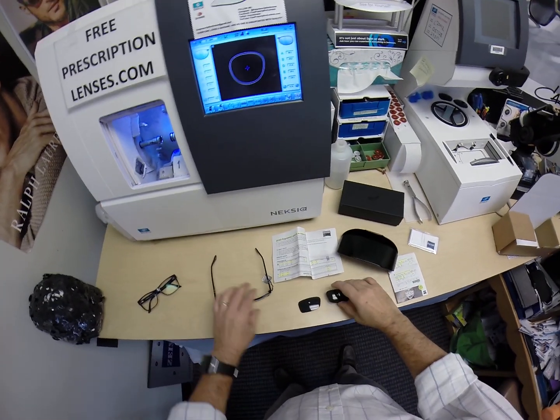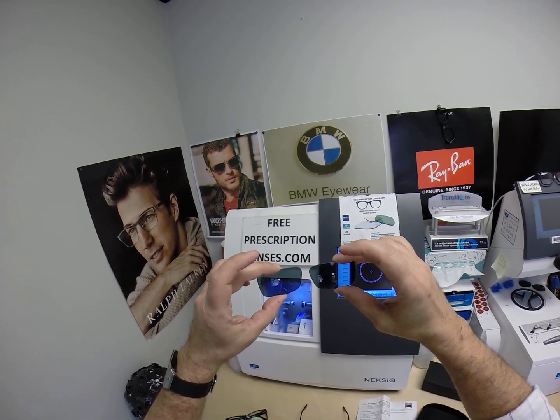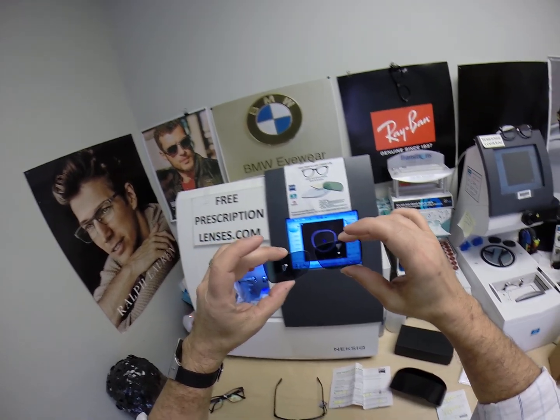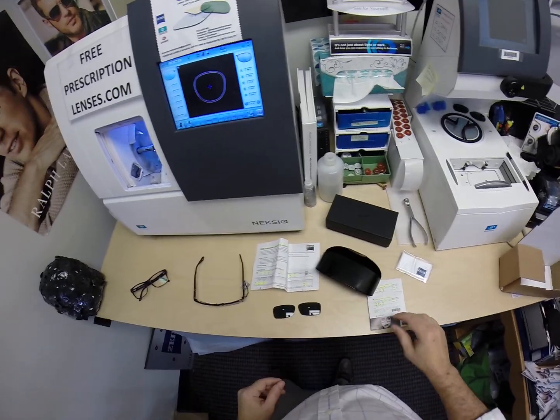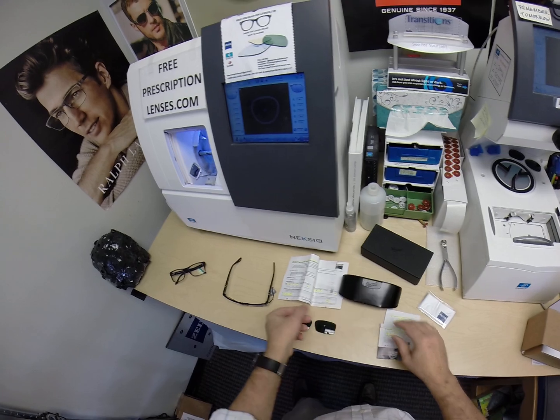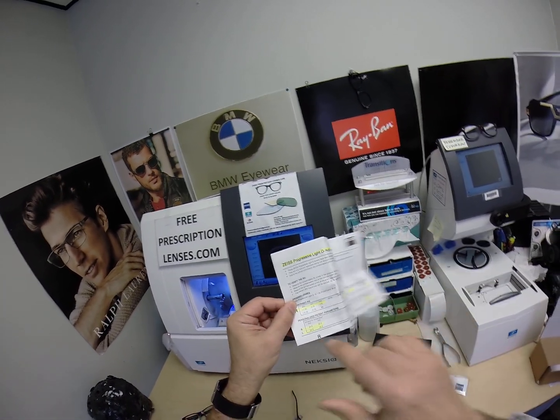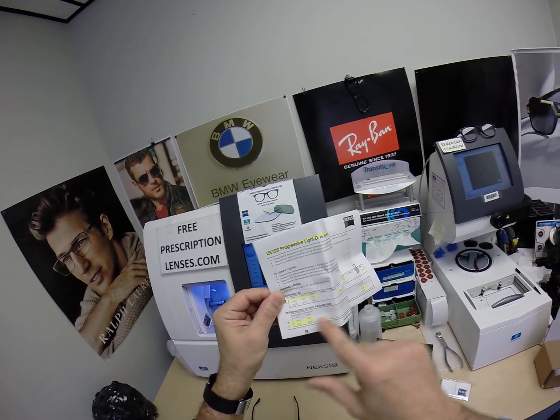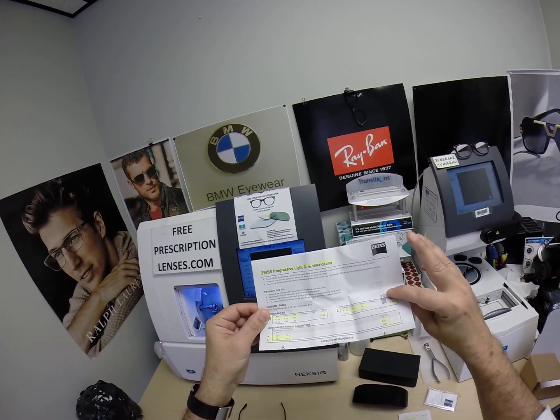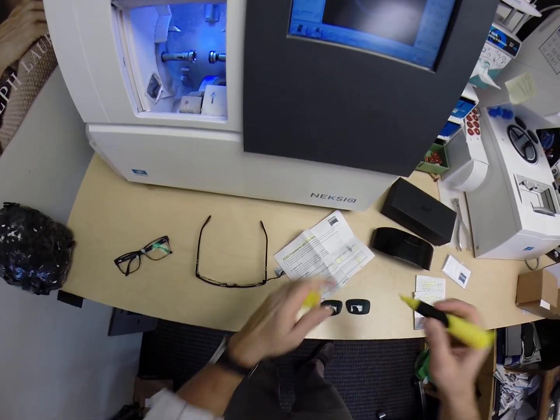One more thing I wanted to point out. For his progressive lenses, I had him put a dot on the lens directly in front of his pupil, so that I'll know where to place the invisible bifocal. Of course, he sent me all his Persol information. I'm going to send him back the Zeiss Light D verification form, highlighting his prescription, pupillary distance, optical center height, base curve. I forgot to highlight. Of course, he'll know it as soon as he puts them on.